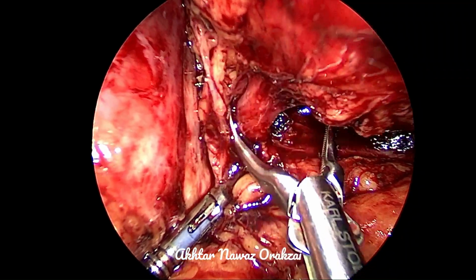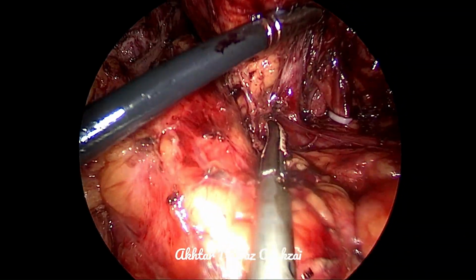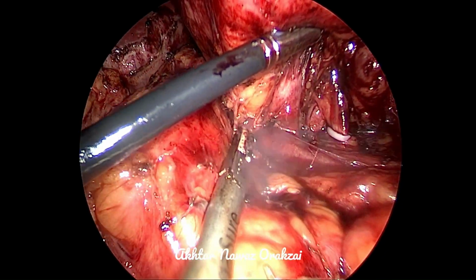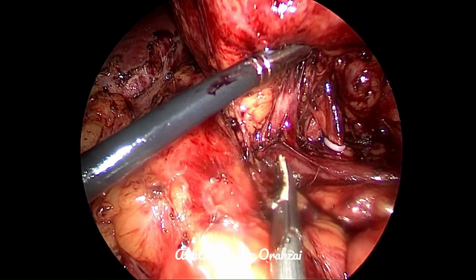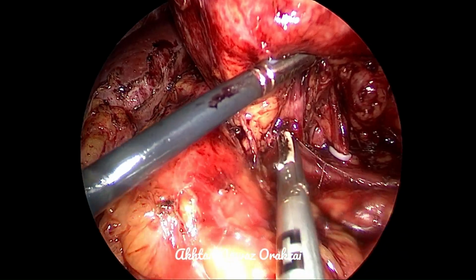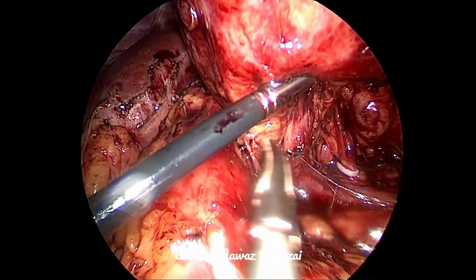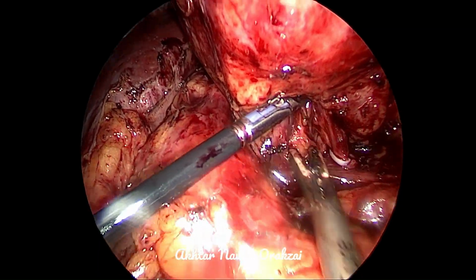It must be noted here that in such kidneys where there is a lot of inflammation, and the kidney is chronically inflamed and fibrotic and non-functioning, the hilum is usually smaller, the vein is usually thinner and smaller, so it can be dealt with easily.